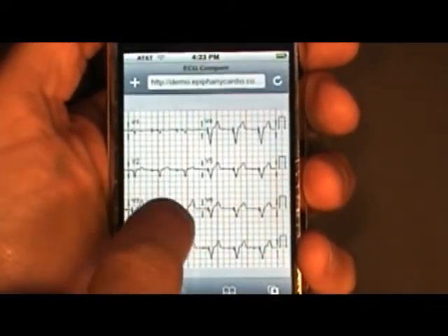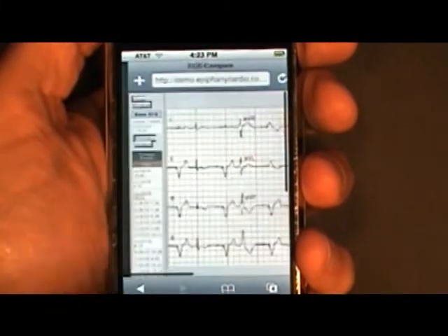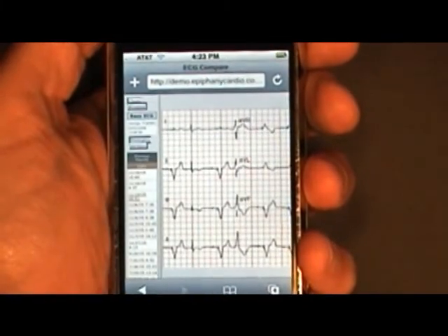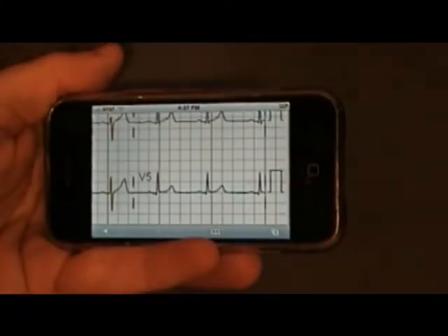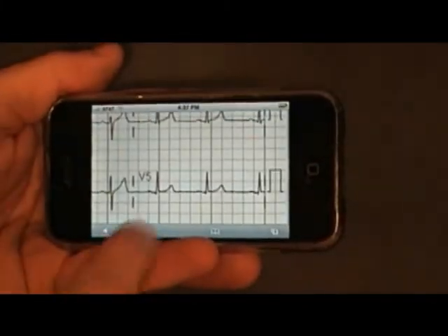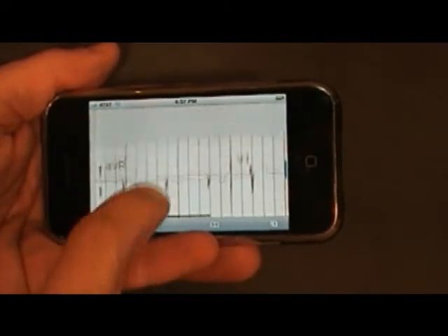Another nice feature of the Apple iPhone is if you turn the device horizontally, it gives you a little bit more viewing angle or viewing real estate to look at your ECGs.